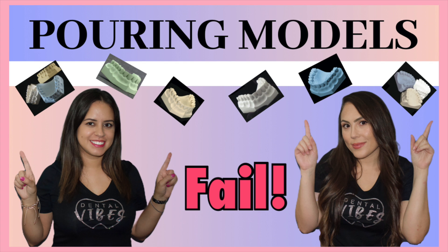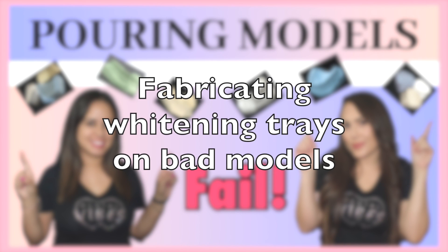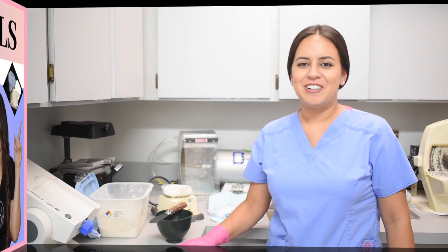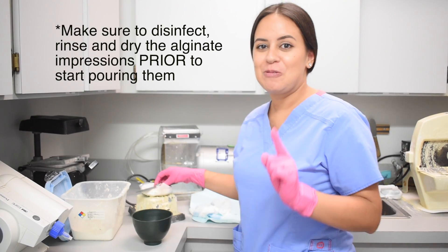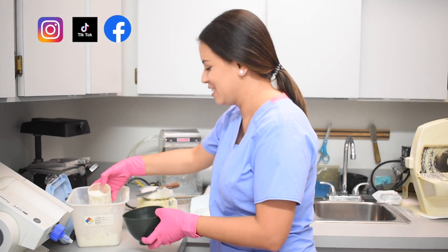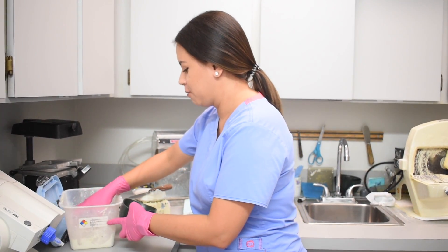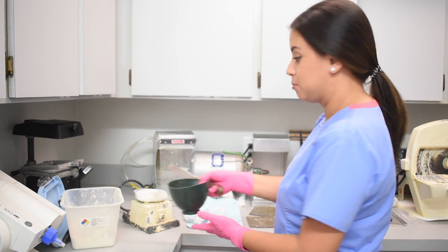We are going to make a great video on how to properly pour models and make them come out looking perfect, so make sure you watch out for that. We're also going to make a video on how to make bleaching trays on these models to show you how to troubleshoot. All right, so we're going to get going and start pouring some models. By the way, I do eyeball the measurements — I know there's probably instructions — but I like to do it for two.